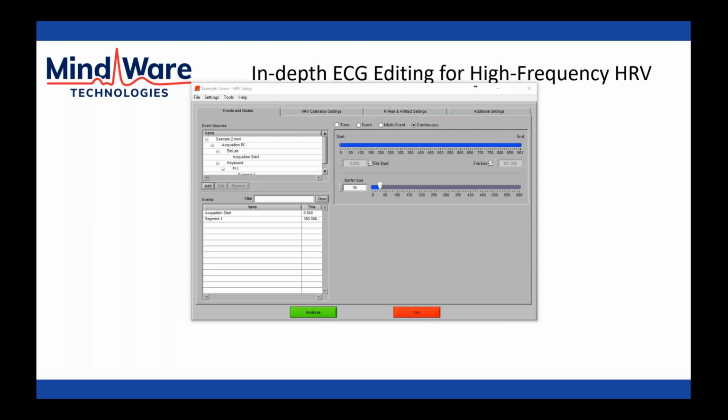And many people, just for the sake of consistency, especially if there are multiple scorers, would say in those situations, just delete and midbeat it. Don't try to interpret it in any more advanced way. Other people will look at it and say, yeah, this does kind of look like a valid peak and there's just a lot of variability. Maybe that's something you're expecting. And in that situation, it may be correct to leave that yellow peak. But again, there's just not any strict rules that I can give you to really dictate when that is or is not appropriate to do.